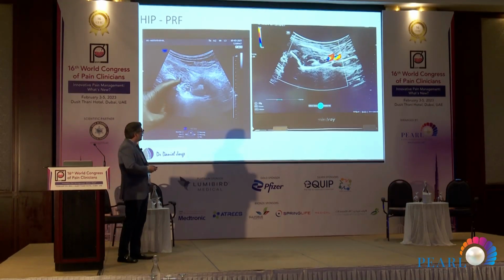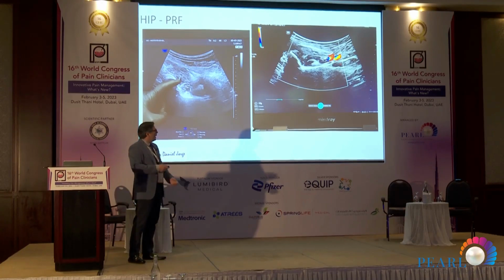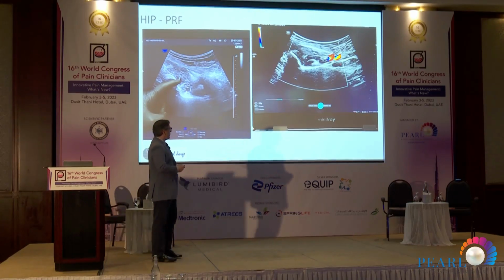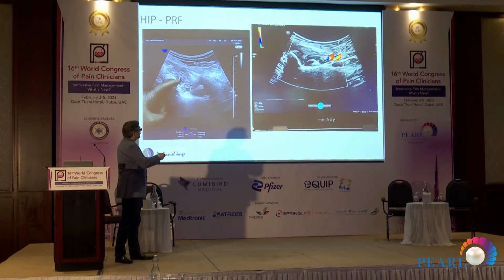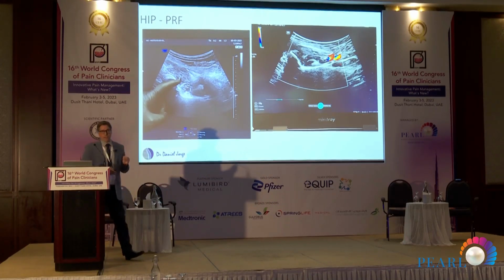So the great point here is that you always have to be aware of the bone floor. We put the transducer in the pelvic region, and you always have to go with your needle only if you are seeing the bone floor. That's going to make your procedure safer. Otherwise, you could be entering the pelvic cavity. So you can make it over here, retract your needle a little bit here, and go over here also. You're going to reach the femoral, lateral, and medial sensitive branches.